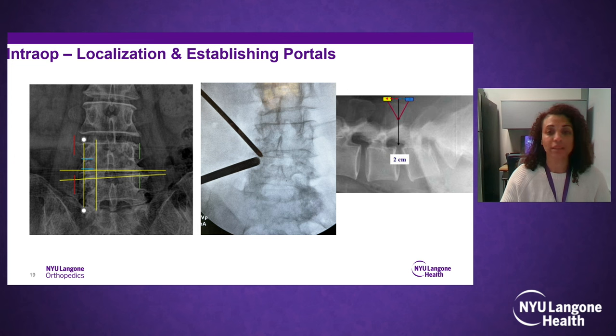So you can navigate these, which I'm starting to do with the robot, and plan out screws based on this trajectory. I measure the thickness of the soft tissue up to the skin on the MRI, and then I just use a screw basically with this length and plan it as if it's going into this area with this trajectory, and then I can use a robot to make my portal incision. And that's been fun to sort of play around with, navigating and then using the robot to localize the portal placement.